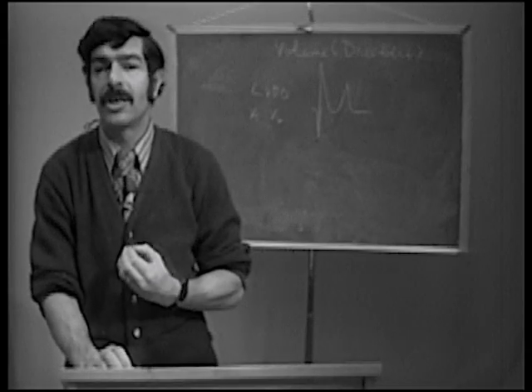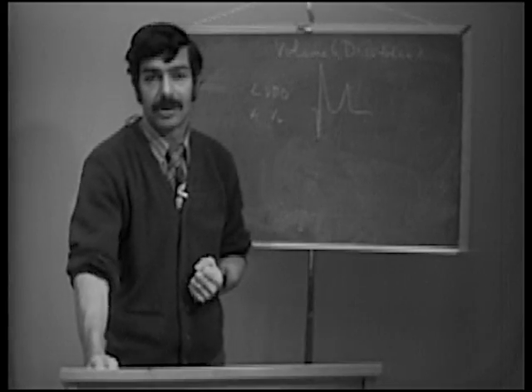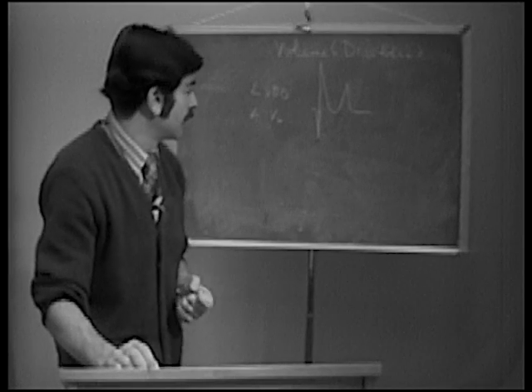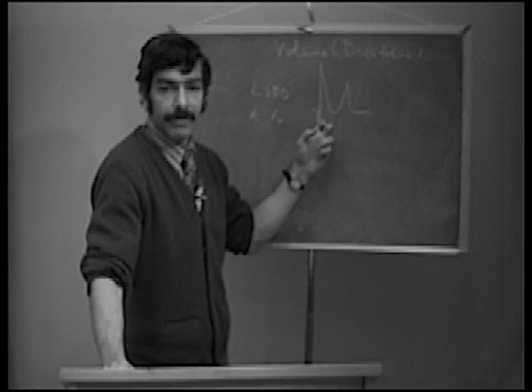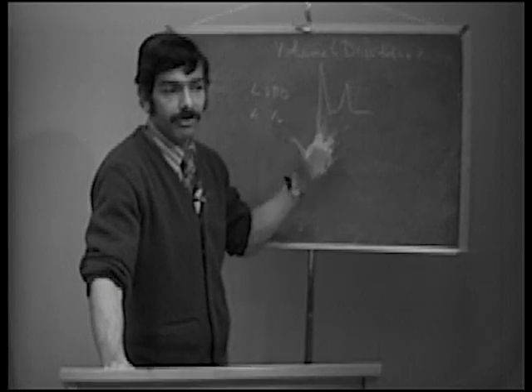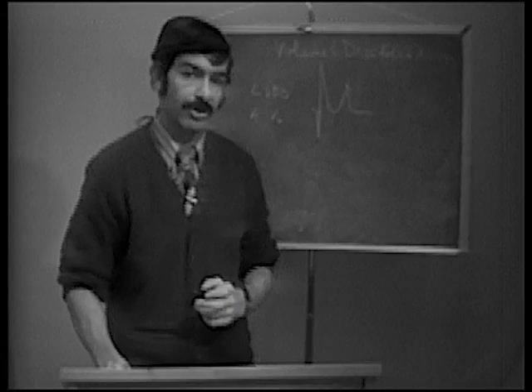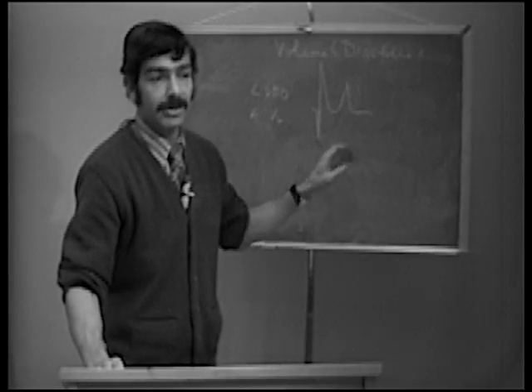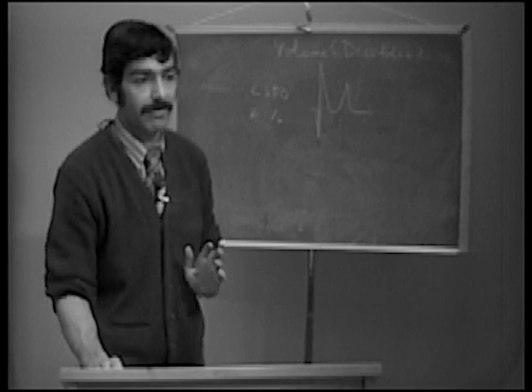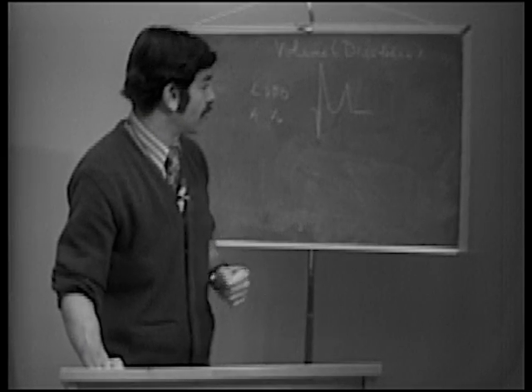Well, what's another thing that enlarges the septum? What causes septal enlargement? Right, outflow obstruction of the left ventricle, for instance, something such as idiopathic hypertrophic subaortic stenosis. This is one of the findings in patients with IHSS. They have a thick septum, so they wind up with a large septal Q.